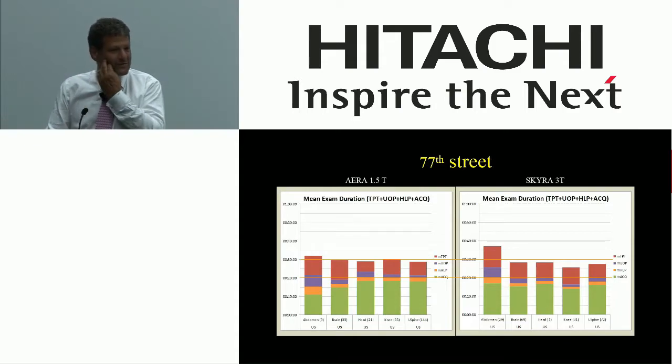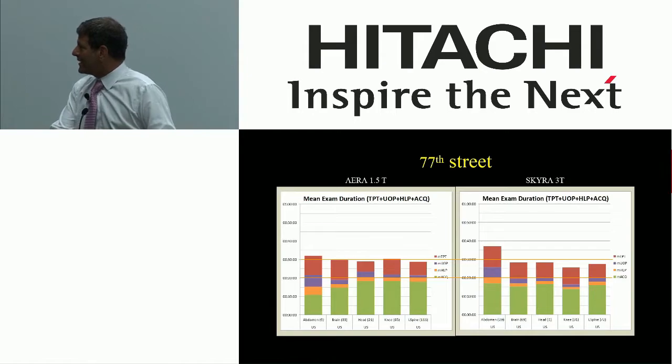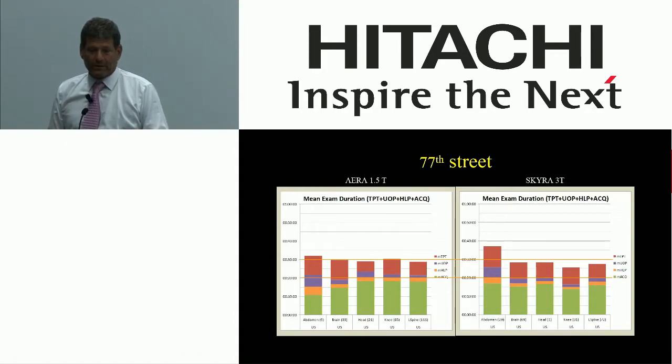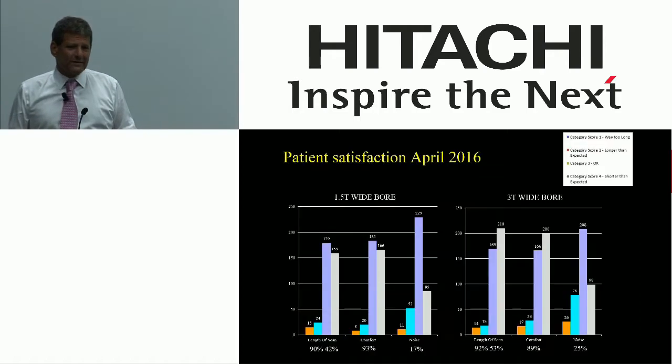Here's our same building, same facilities, same practice. On the left is a 1.5, on the right is a 3T. Same practice, same value-driven architecture, same sequences that we want to run. And you can see here that the diagnostic green bars are just a bit shorter than on the opposite side. Some of this stuff has too small a sample, but look at what the doctors are doing here. We're just a little bit shorter across the board. So definitively shorter. So that couldn't make a difference, right?